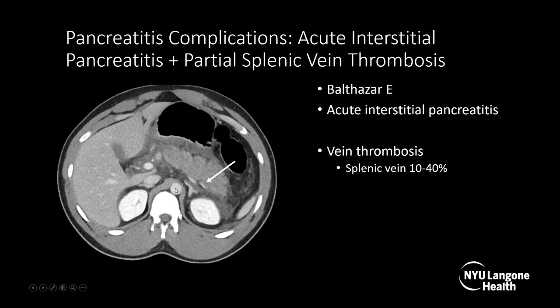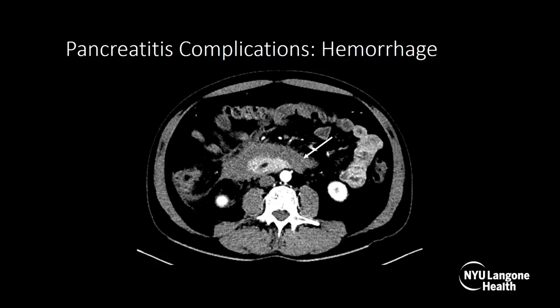On this axial CT with IV contrast, the pancreas is enlarged and there's fluid surrounding it extending on both sides of the abdomen — a Balthasar grade E pancreatitis. There's no necrosis, so this is an example of acute interstitial pancreatitis as described by the revised Atlanta classification. The arrow points to a partial splenic vein thrombosis — a portion of the splenic vein enhances, but a portion does not. Splenic vein thrombosis occurs in 10% to 40% of cases. A dense area in the posterior aspect represents hemorrhage, which may be from a pseudoaneurysm.